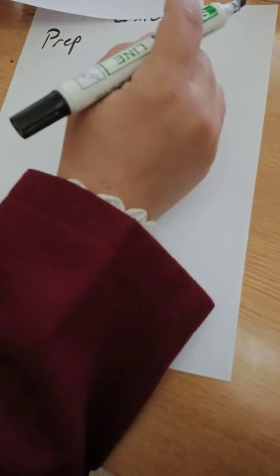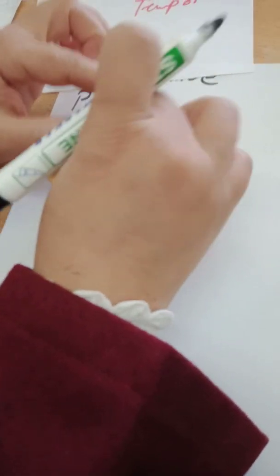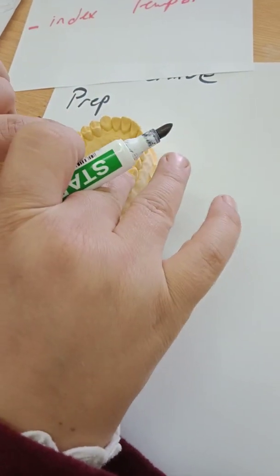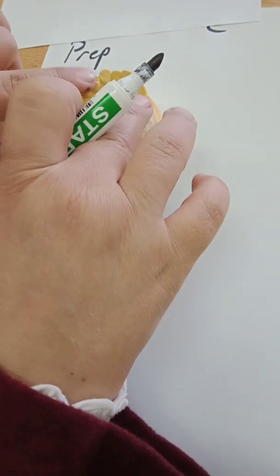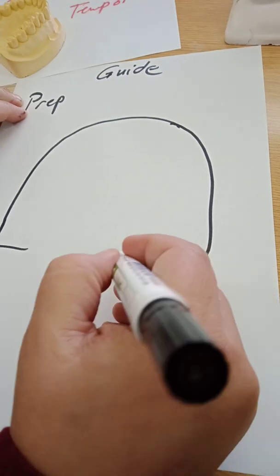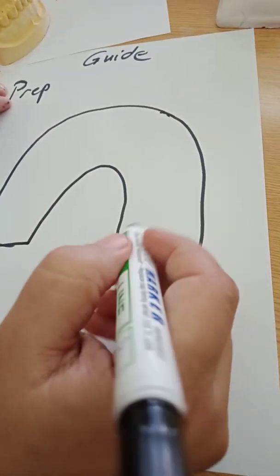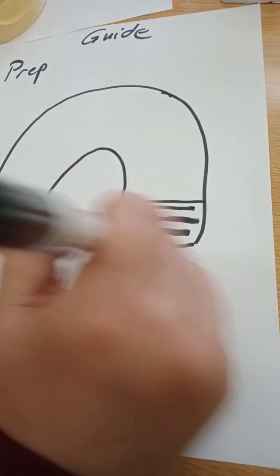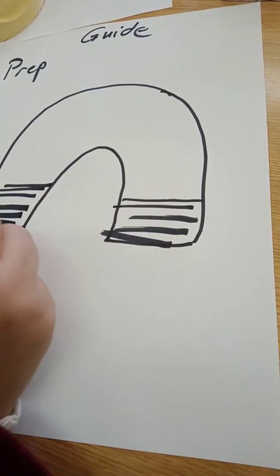I first of all bring a lump of silicone over the teeth. I leave over the occlusal surface some of it, and then I press it in place, reaching up to the molars, because these will be used as stoppers. And then I place it, and it's in a bulk like this. Now if I invert it and look at it from the inside, it will be like this. So I will leave the area on the molars intact, covering the molars from the lingual and palatal.